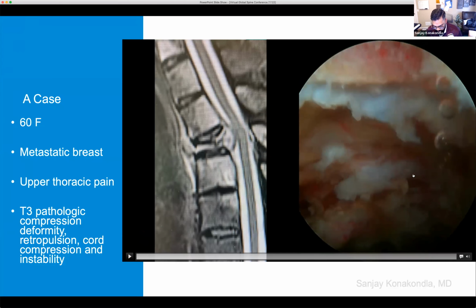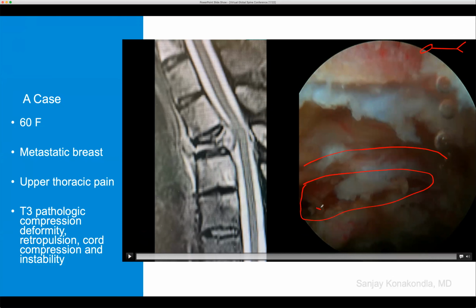Just to orient, this is the orientation there. This is the remaining portion of the SAP. As we play this video, you'll start seeing pulsations in this area. It's always nice to identify the epidural space in that manner. We can see epidural fat, and behind that remaining piece of bone and fragments, you can see some of the spinal cord, or the dura around the spinal cord.